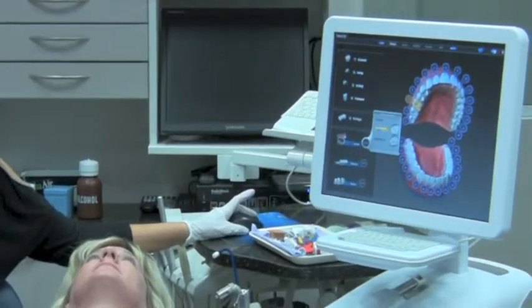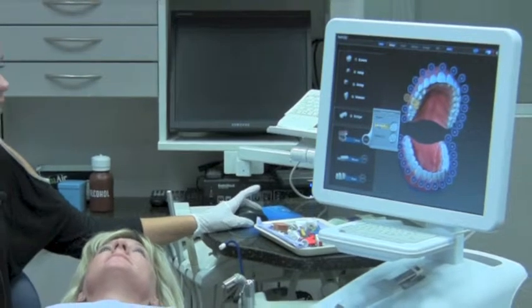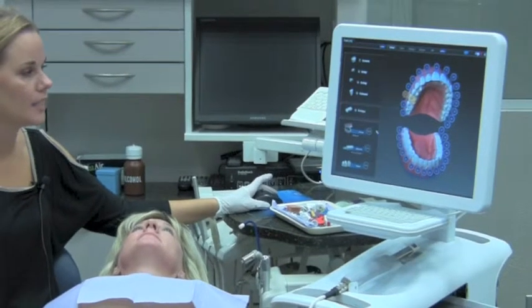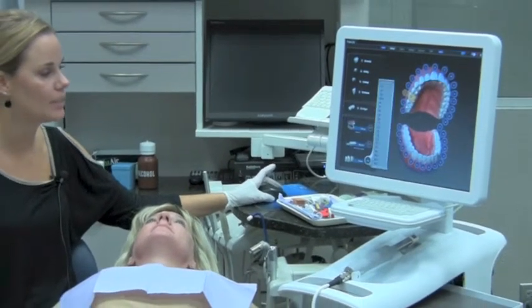We choose our library of anatomy — I prefer Lee Culp's Library of Anatomy. For our material, in this instance I would choose a Low Translucency Emax. And Terry's shade is a BL3.